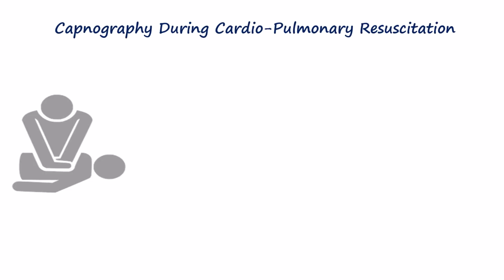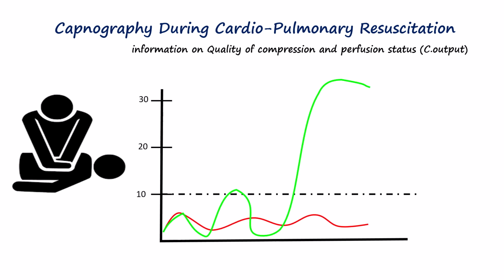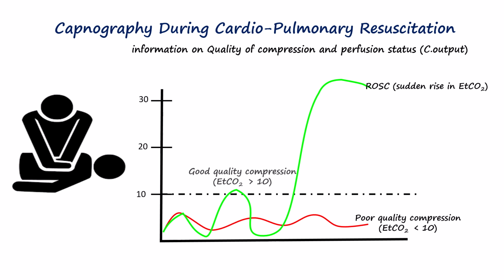Capnography is a valuable tool during CPR by providing real-time information about the effectiveness of chest compression and overall perfusion. Since CO2 is transported to the lungs via circulation, the presence of end-tidal CO2 reflects cardiac output. A sudden rise in EtCO2 is often the first sign of return of spontaneous circulation or ROSC. Conversely, persistently low EtCO2 levels, typically below 10 mmHg, may indicate inadequate or poor compression quality.